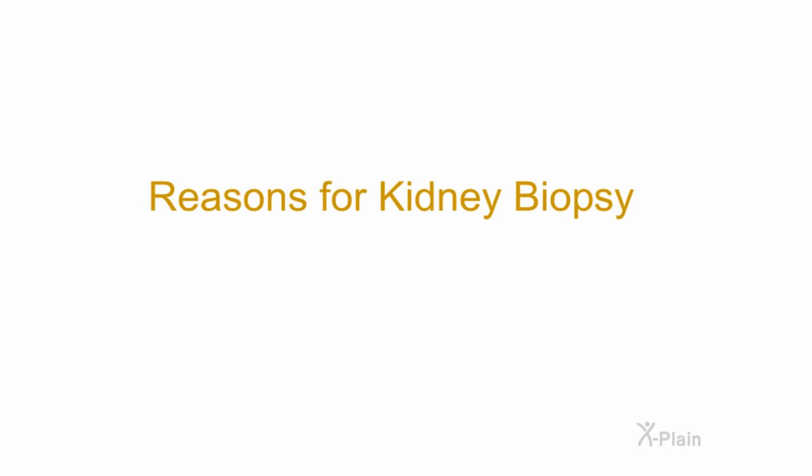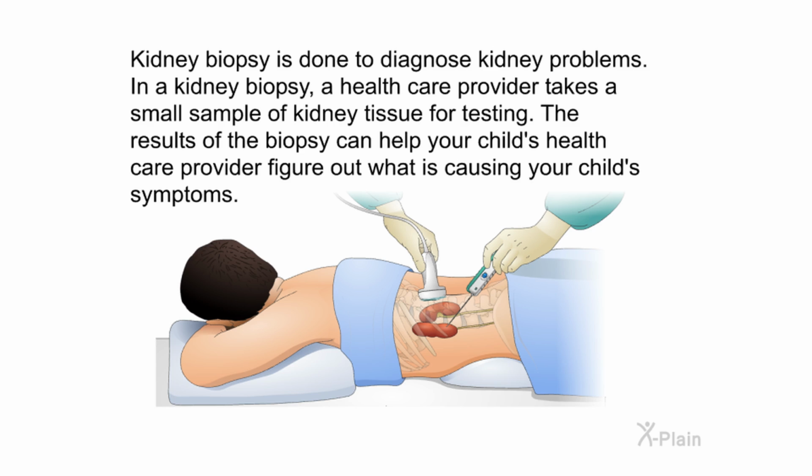Reasons for kidney biopsy. Kidney biopsy is done to diagnose kidney problems. In a kidney biopsy, a healthcare provider takes a small sample of kidney tissue for testing. The results of the biopsy can help your child's healthcare provider figure out what is causing your child's symptoms.